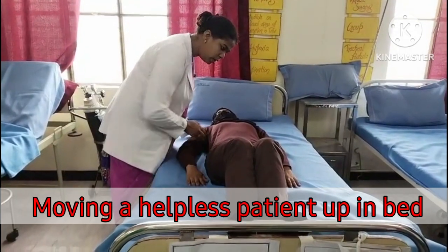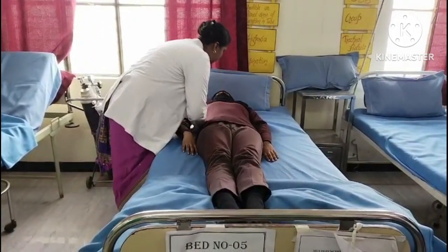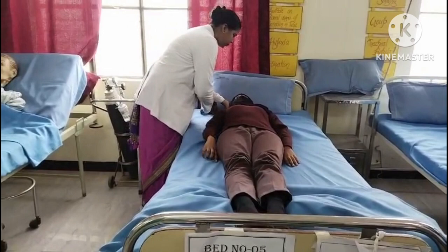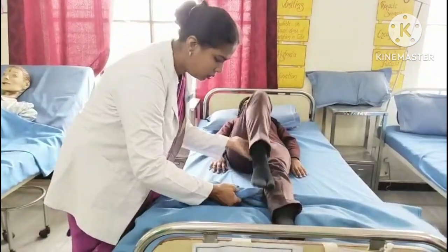On count of three, shift your weight from front to back foot, at the same time shifting the patient to the top of the bed. Tighten your gluteal, abdominal, leg and arm muscles. Position patient as required.